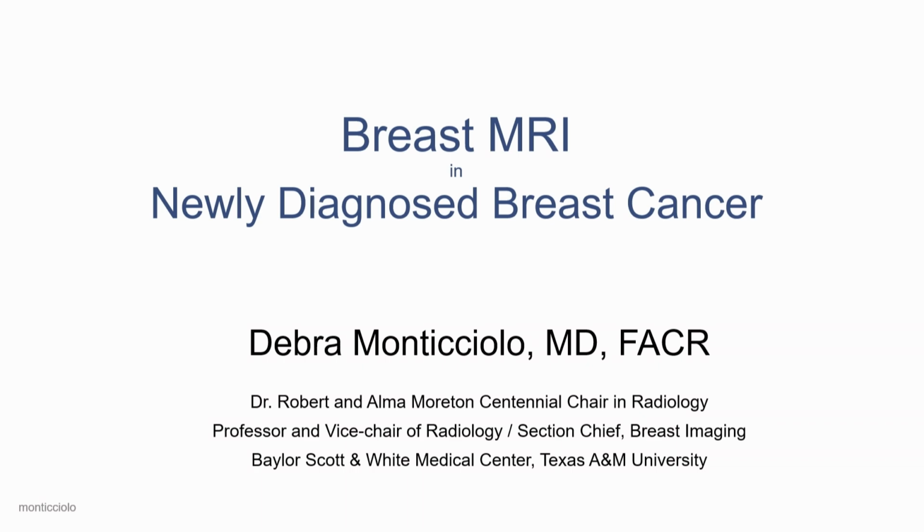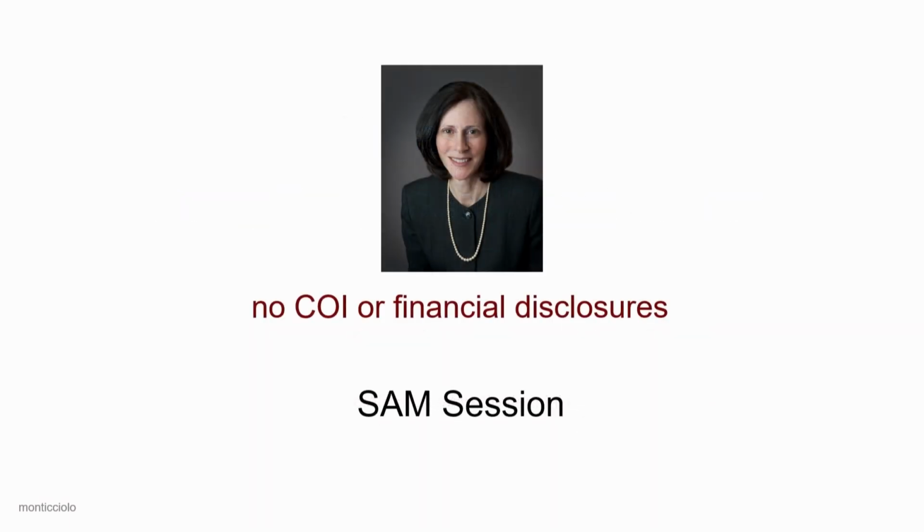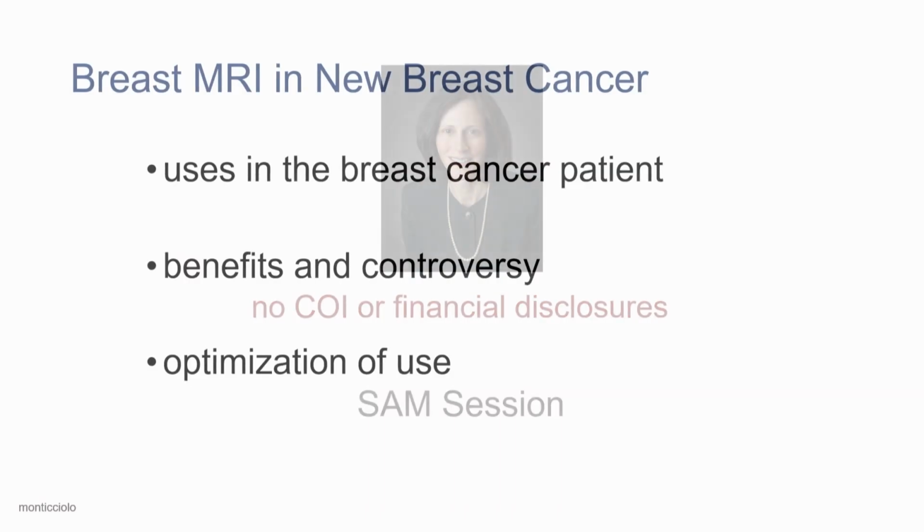All right, so my first talk is breast MRI in the newly diagnosed breast cancer patient. I don't have any conflicts of interest or financial disclosures, and this is a SAM session, so you may get hints from me about what these SAM questions might be, because even though you don't have to get them right, it's kind of nice to get them right, isn't it?